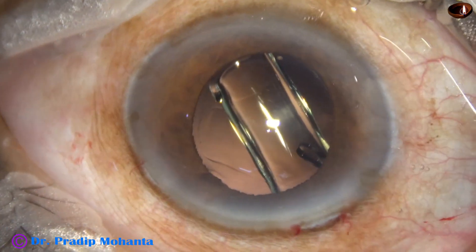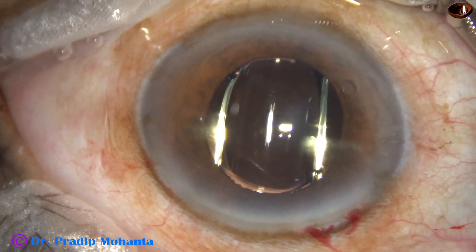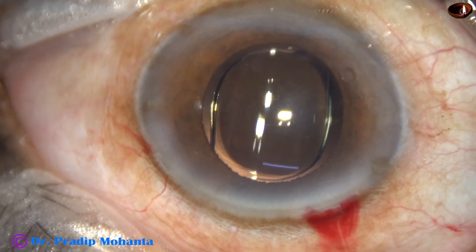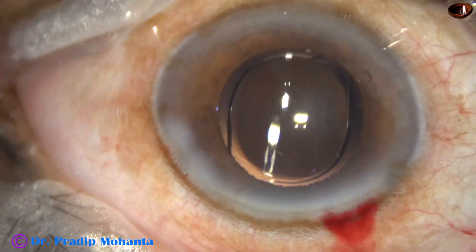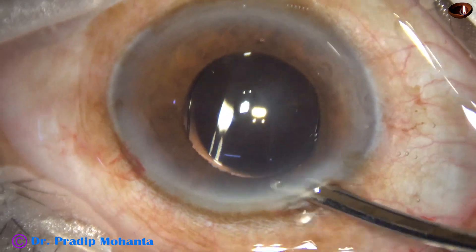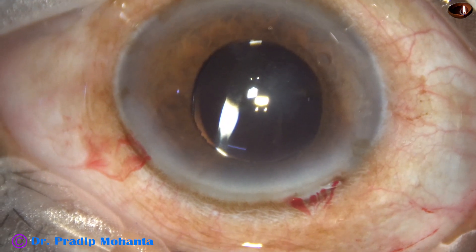Hydro-implantation of a single-piece monofocal intraocular lens is done. This is a bit of moxifloxacin. The side ports are closed by hydrating the corneal stroma, and then a final lavage of the anterior chamber is done. The entire chamber is nicely formed and the case is concluded.